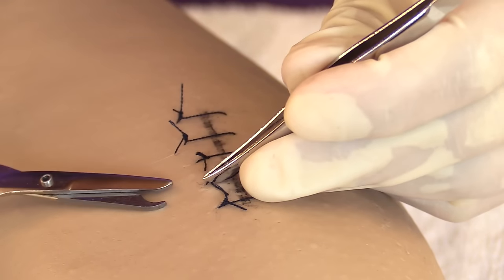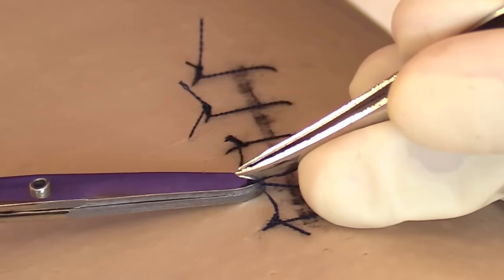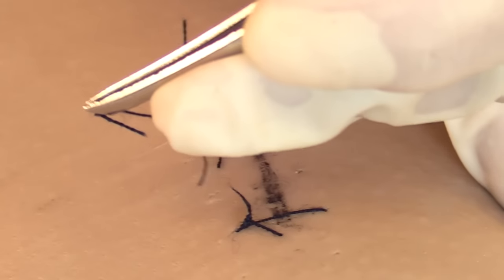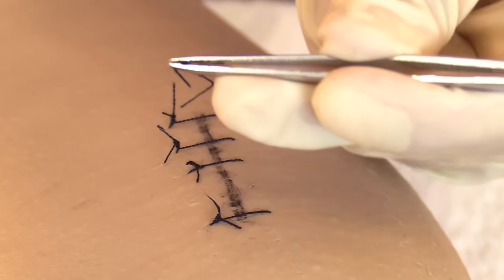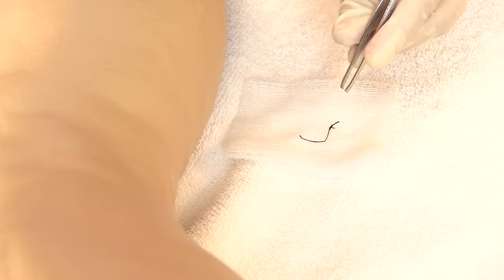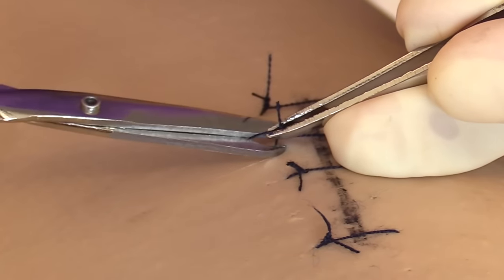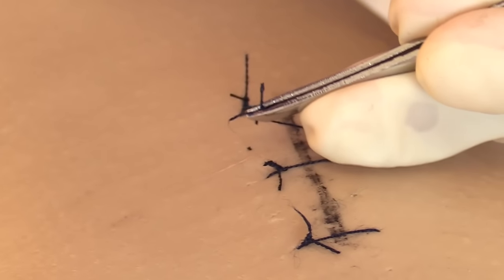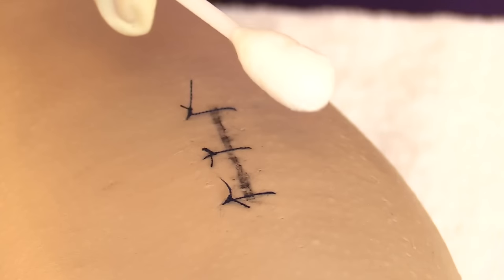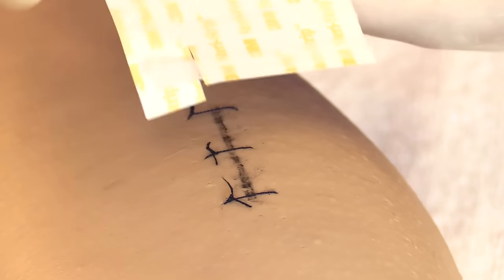Grasp the knot with tweezers, then take the scissors and cut that portion of thread closest to the skin. Lift up and pull over the wound. Check that the suture is intact and hasn't fallen apart, then drop it into the gauze. Repeat the same steps for the next alternate suture: grab the knot, snip underneath it, lift up, pull over the wound, check the thread, and drop it in the gauze. Then take a new antiseptic swab and clean the areas where you removed the sutures, and let them dry.